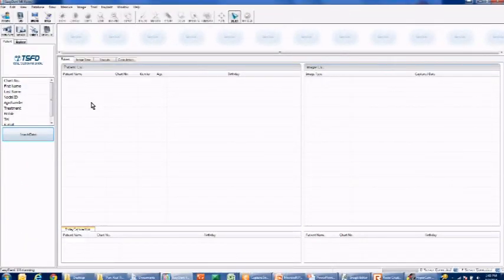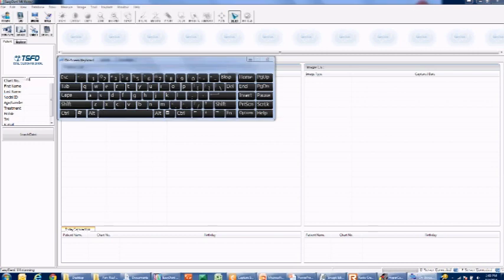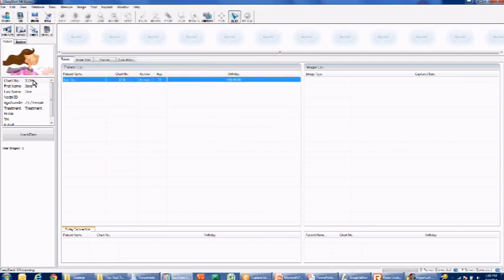We'll begin our process by searching for our patient within the EasyDent4 viewer, either by chart number, first name, or last name. In this case, we'll do a search by chart number, enter our number, select enter on the keyboard, verify this is the correct patient, left click on the patient under the patient list, and then left click on the icon that states Dental CT.